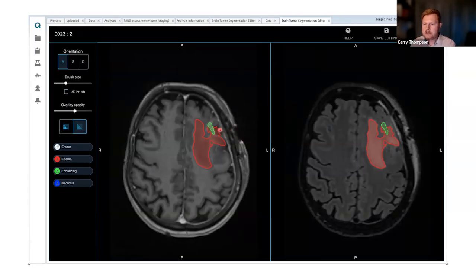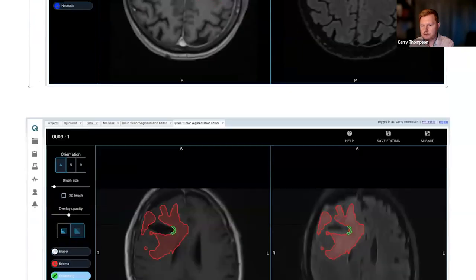Now, an important point here is highlighting the human in the loop, because a lot of automated segmentation algorithms aren't actually optimized or don't deal well with immediate post-operative imaging, where you have blood products and air and often some post-surgical material. So having the expert have the ability to go in and edit this and make sure it's robust is really important, having the side effect that these data then can be used to go back into the loop and train algorithms, so that you may have a separate optimized AI for segmenting on the post-operative imaging that allows you to be compliant with RANO Resect.